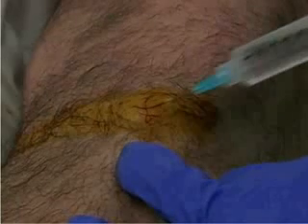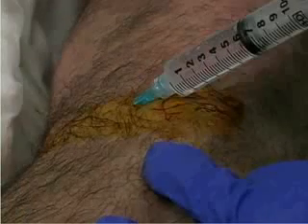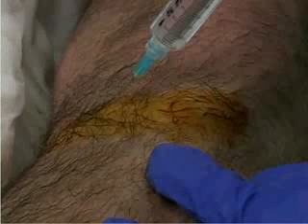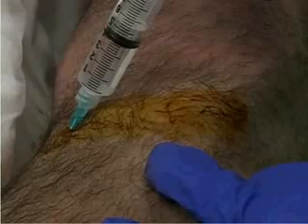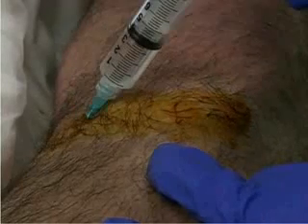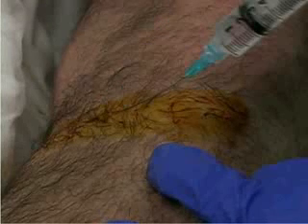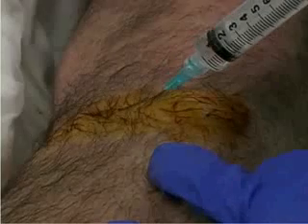Reinsert the needle into the cutaneous wheal 2 centimeters from the tibial tuberosity and again direct the needle medially. Inject the local anesthetic in a ring technique, infiltrating linearly to the dorsomedial aspect of the tibial condyle. Inject approximately 10 milliliters, causing the subcutaneous tissue to visually rise.